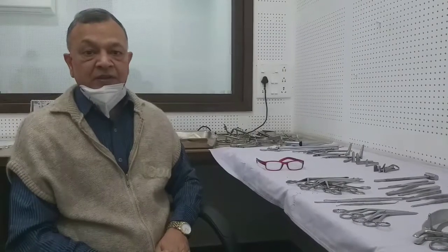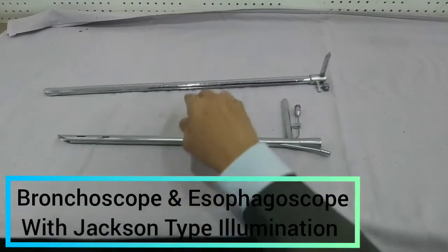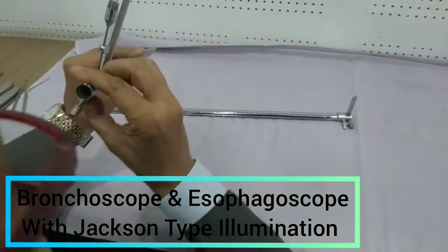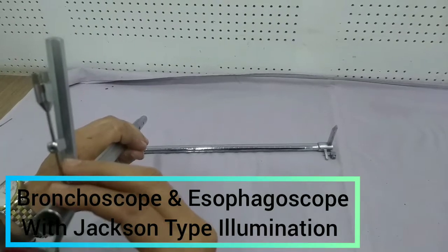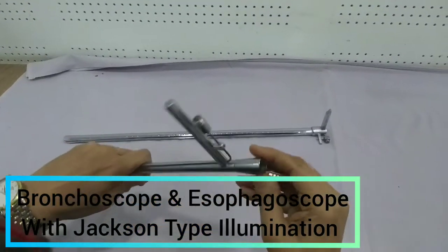Hi friends, good morning. Today morning I will show you the instruments. This is the bronchoscope and this is the esophagoscope. Both these scopes are having a hollow metal tube, so through this tube we can watch the structures inside — the bronchus, trachea, or the esophagus.